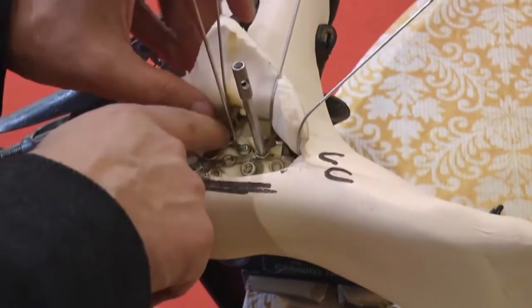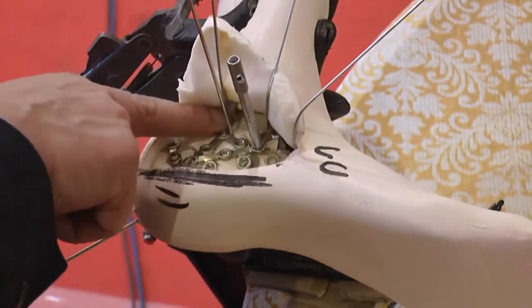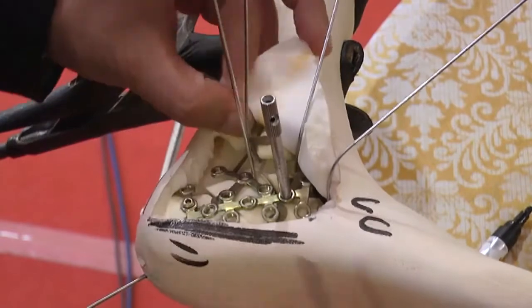This is the sustentacular screw, 2.5 drill bit. So close to the wire, there is a hole which can very easily take a sustentacular screw there.